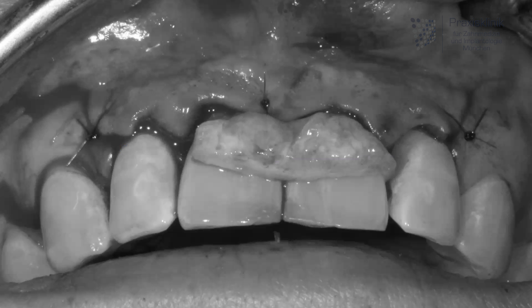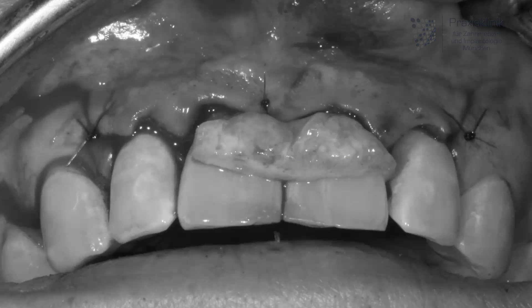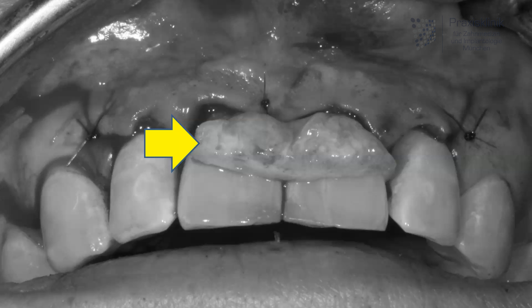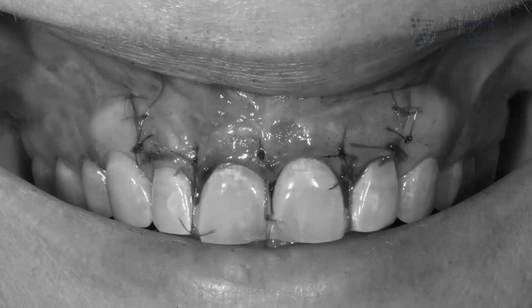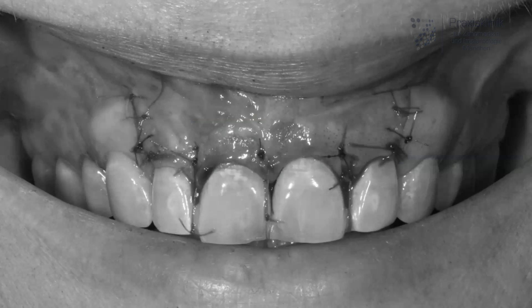If we want to make the gums more stable, we place an additional connective tissue graft taken from the palatal aspect of your mouth, indicated with the red arrow. That tissue graft is placed on the labial aspect of your teeth and the membrane. Thank you very much for your kind attention.